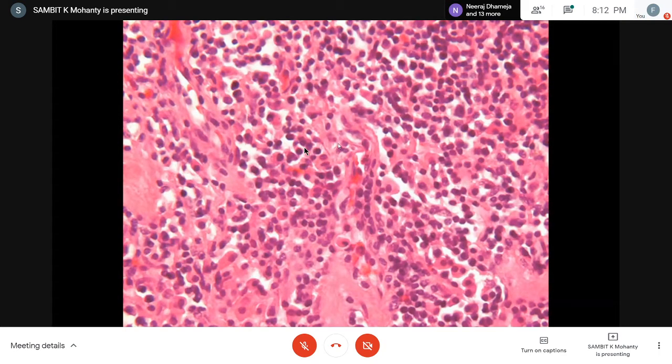Okay, Shilpi, you look at the cells. It looks more like a non-neural tumor. It doesn't look neural. It looks like something different, and as you said, it looks more lymphoproliferative. Okay, can you be more specific? I don't see any glial background, sir. No fibrillary glial or neuropil, nothing like that. And there's no meningothelial differentiation, as the MR person said.